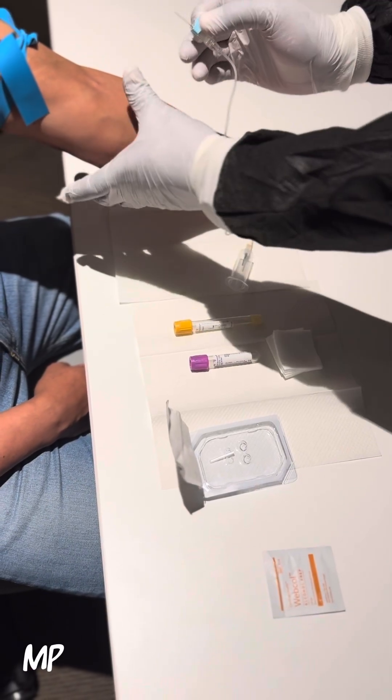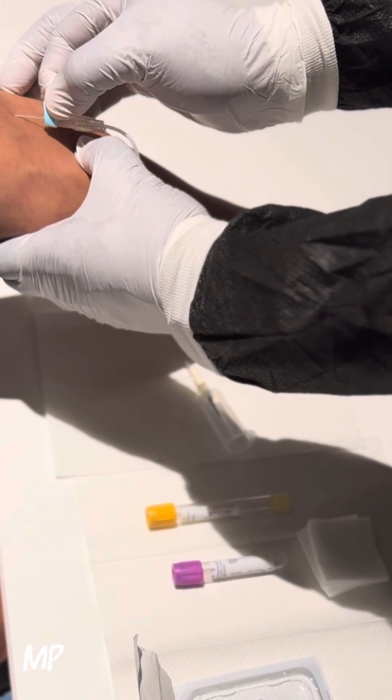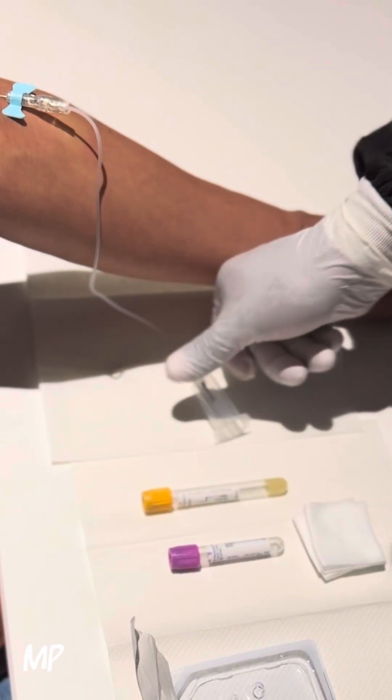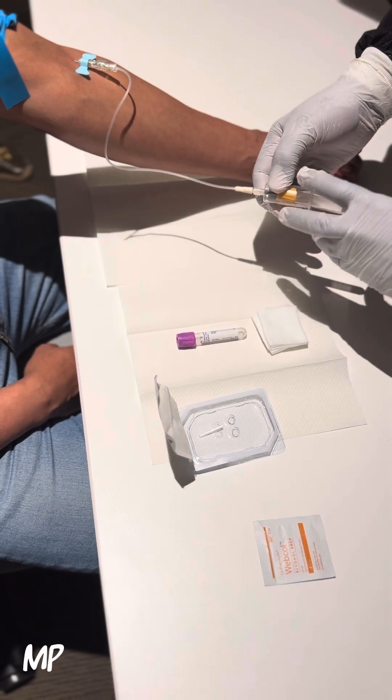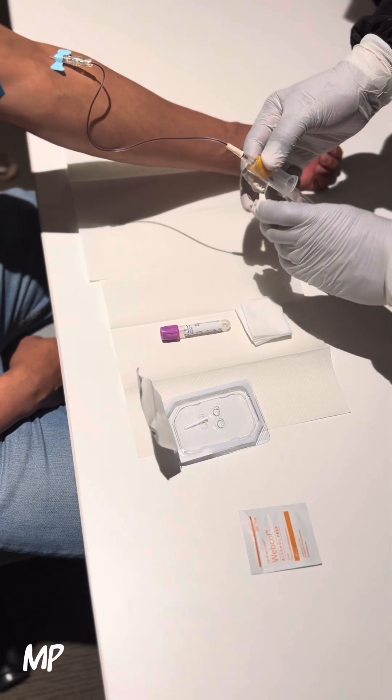Pinch and fold the wings, anchor so the vein doesn't roll. Five to ten degrees, go in, make insertion. Put on your vacutainer tube and allow the blood to flow.